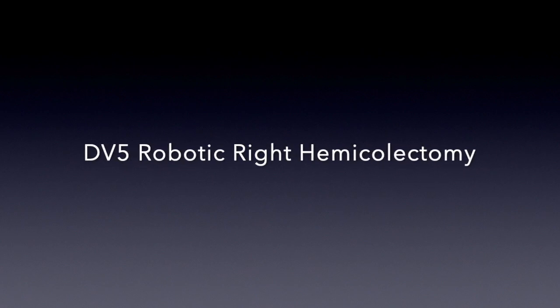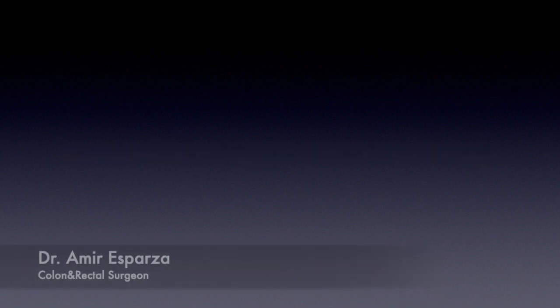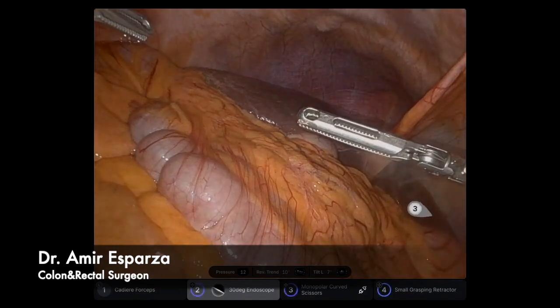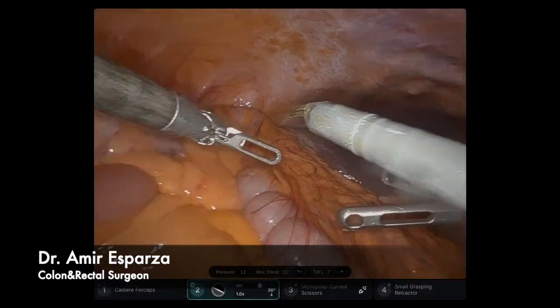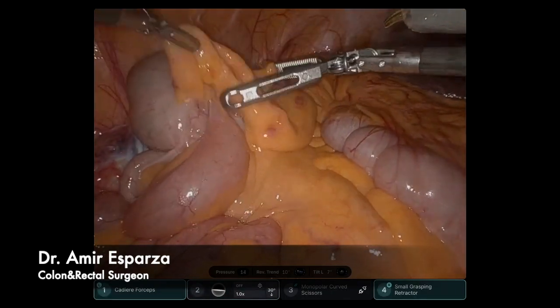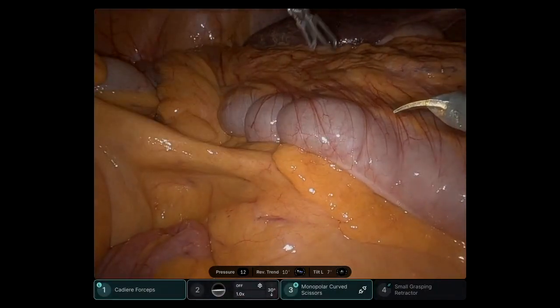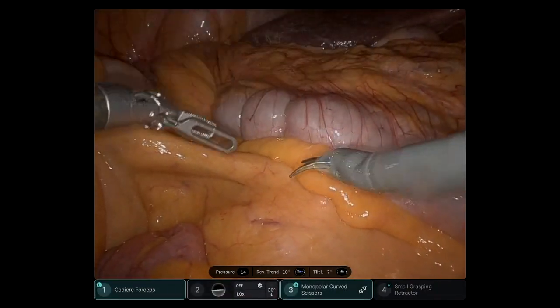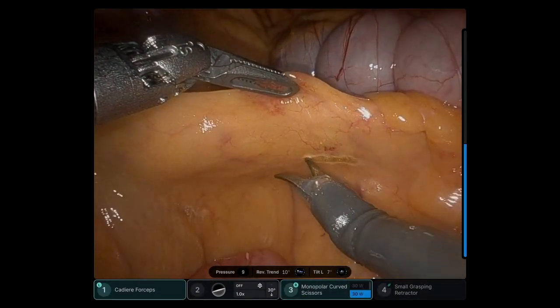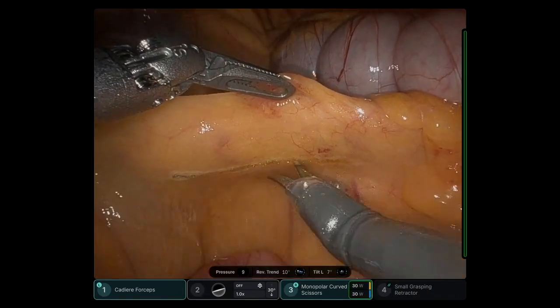Hello, this is a short video about a robotic right hemicolectomy using the newly launched DaVinci 5, or DV5. My name is Dr. Amir Esparza. This was one of the first cases done in the state using this new technology, and I'm going to describe a little bit of the surgery as well as the benefits of the DV5 on this video.